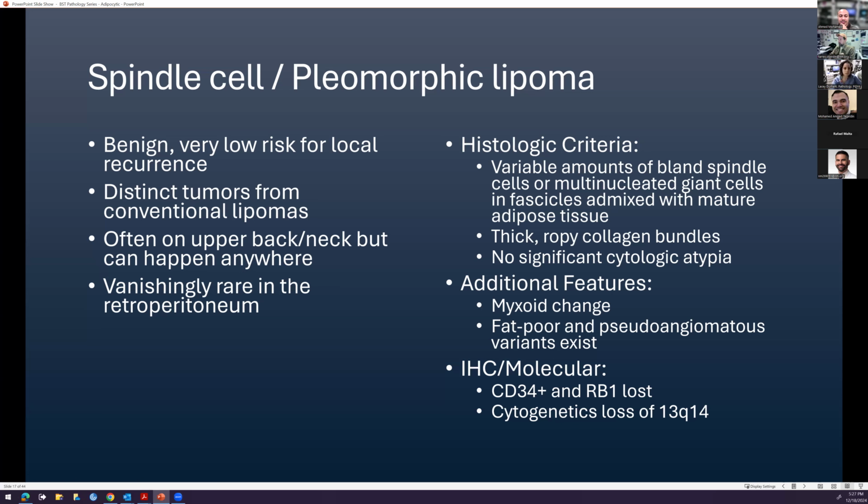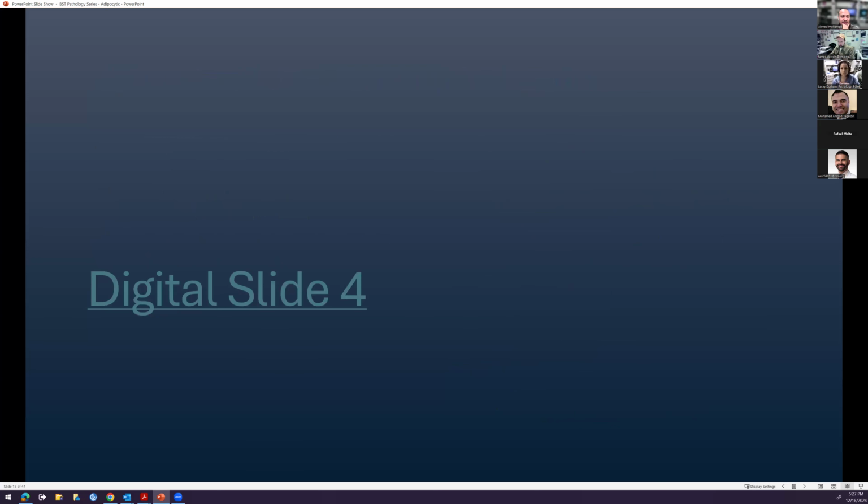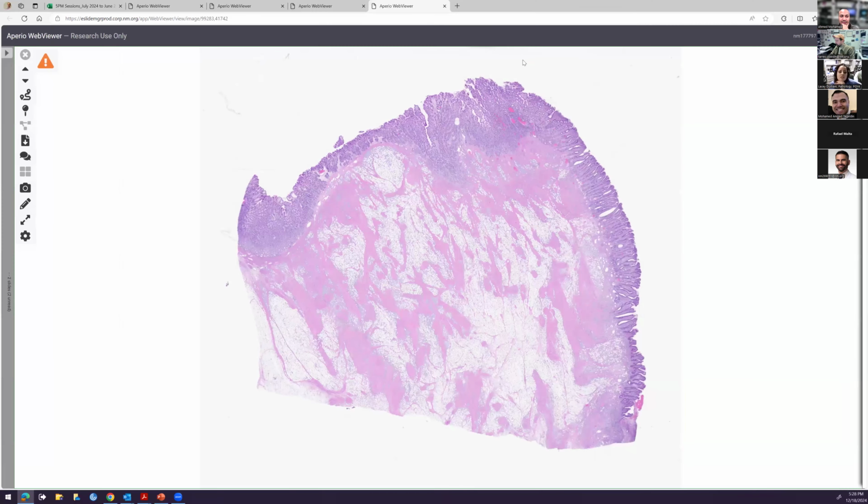Cool. All right. Moving on. There's another slide here. Let's take a look. Okay. Let me put this up here. Let's start with this one. Here we go. All right. So, okay, where are we first of all?